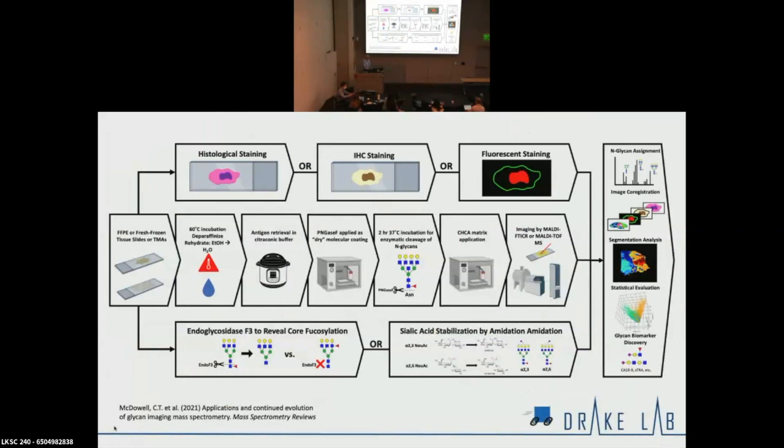A note on the methods. We worked out the antigen retrieval. For whatever reason, citraconic acid, a little acidic, works beautifully and fairly reproducibly, but it's pretty flexible. As Peggy indicated, we can do any IHC we want now once she worked that out.